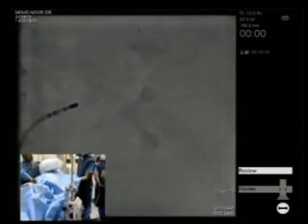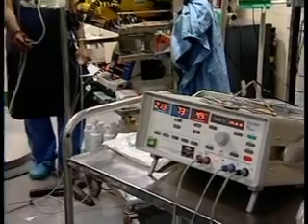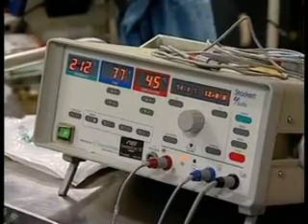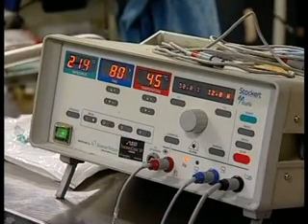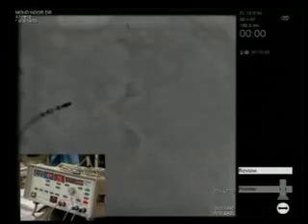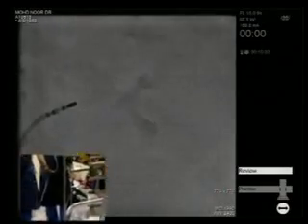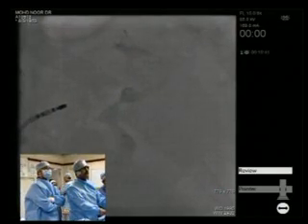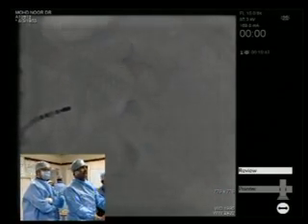So all that we do is take the distal side, put a marker there. I don't know whether you can see, there is a marker that has been pasted on the fluoro screen so that we know where it is, and then we have the idea where the ostium is, and we deliver lesions in between, guided by the impedance. The second question is, how did you take the RF catheter into the renal artery? Did you take it through a guiding catheter? Yes, we have a renal guiding, and it's gone through a guiding.